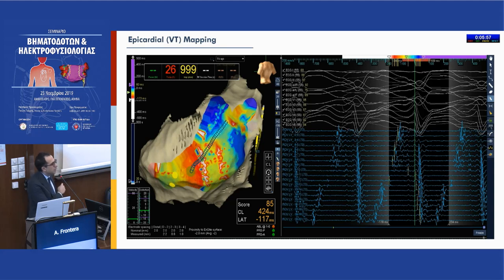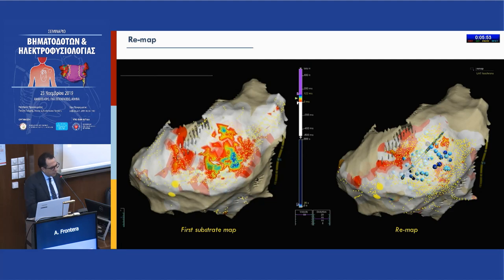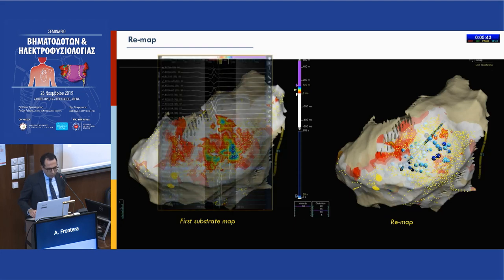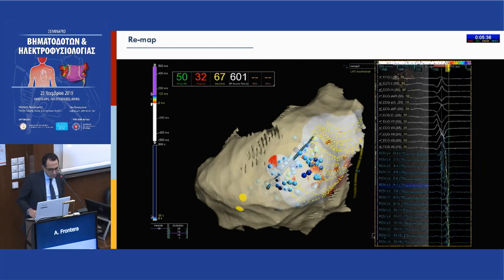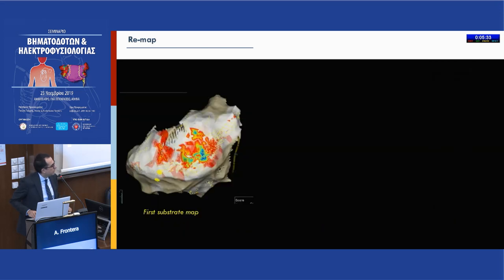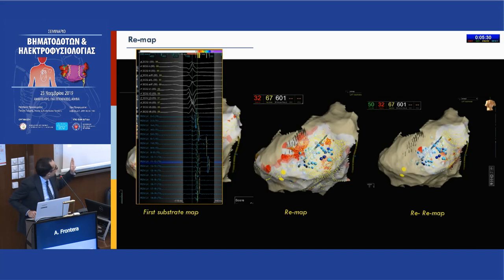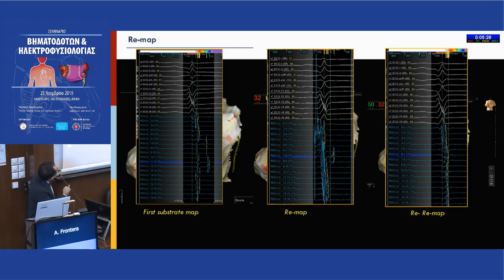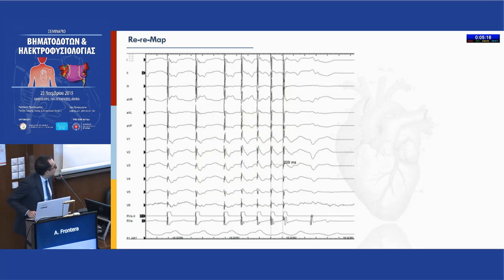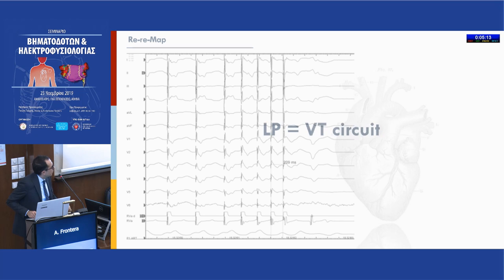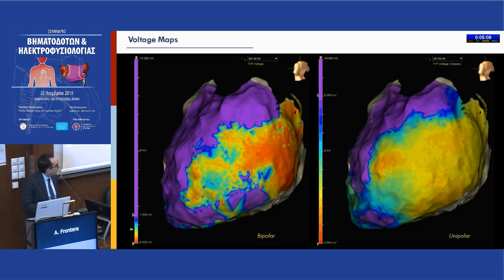We placed the multi-spline catheter epicardially and obtained the full depiction of the VT circuit — entrance, isthmus, and exit site. Then we did a remap: the first map showed late potentials, the second map still showed some remaining signal, so we ablated more. We continued until we achieved complete abolition of the signal — no more late potentials on the final map. The last ECG shows four extra stimuli: non-inducibility. Late potentials are the VT secret and always codify for the VT circuit.